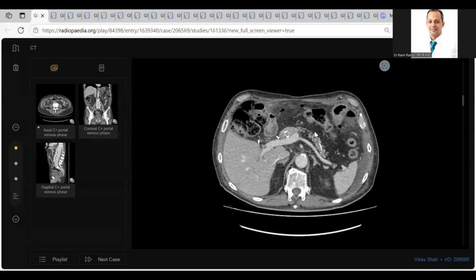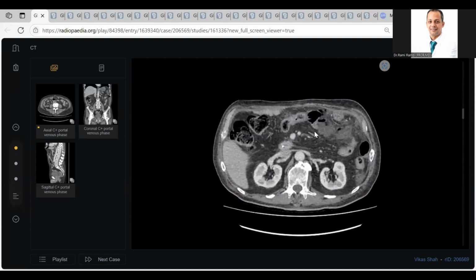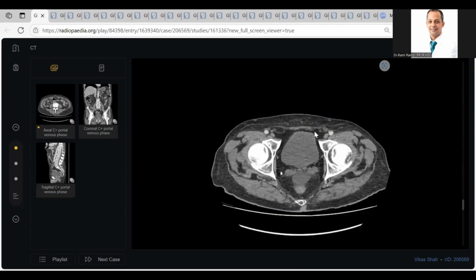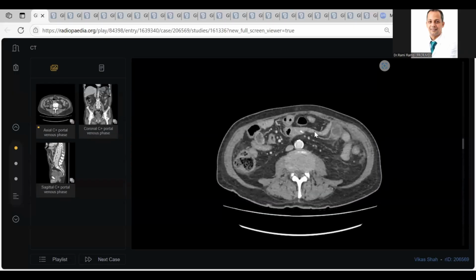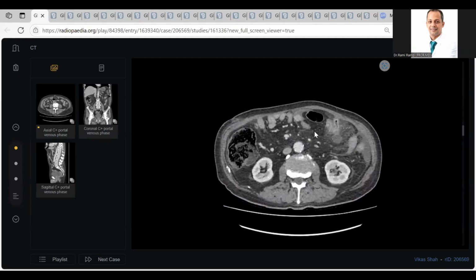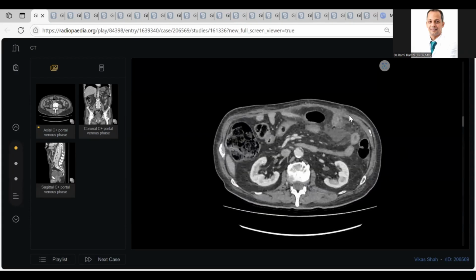And please, my colleagues, when you come to an area of finding, don't escape. Most of you go down, down, down. Please, first, even the first time, make a whole scan. Then please return again here. This is the site, this is the key, this is the pathology. What happened here? Some fluid collection surrounding one bowel.